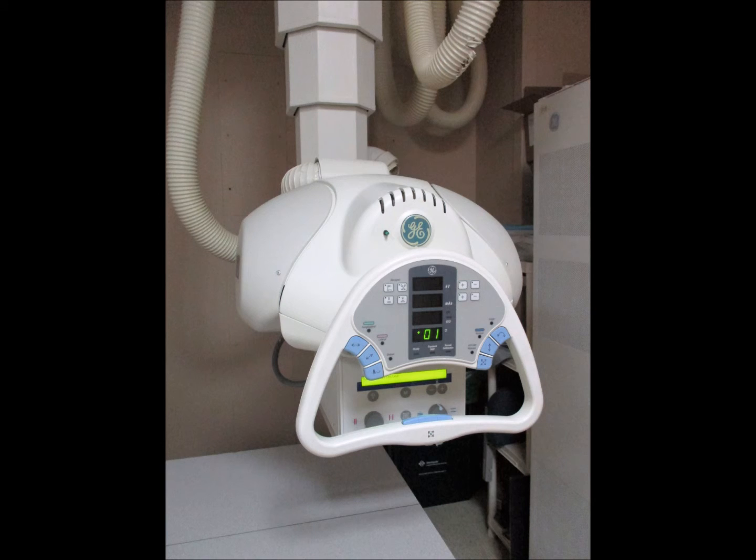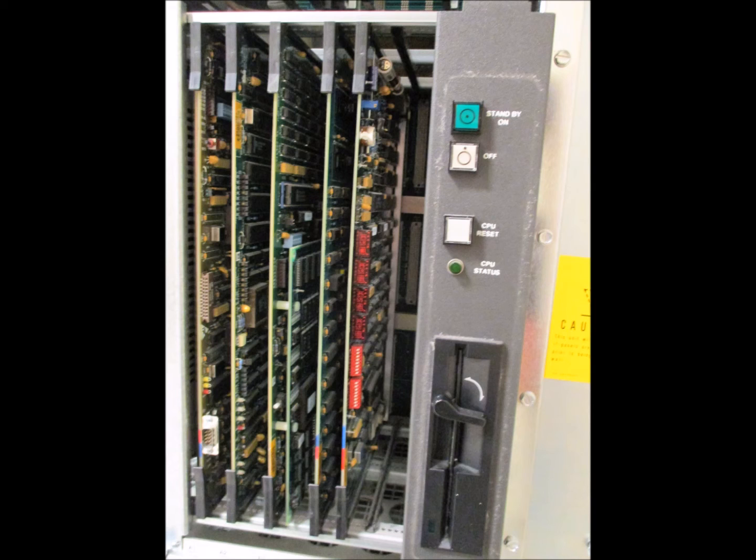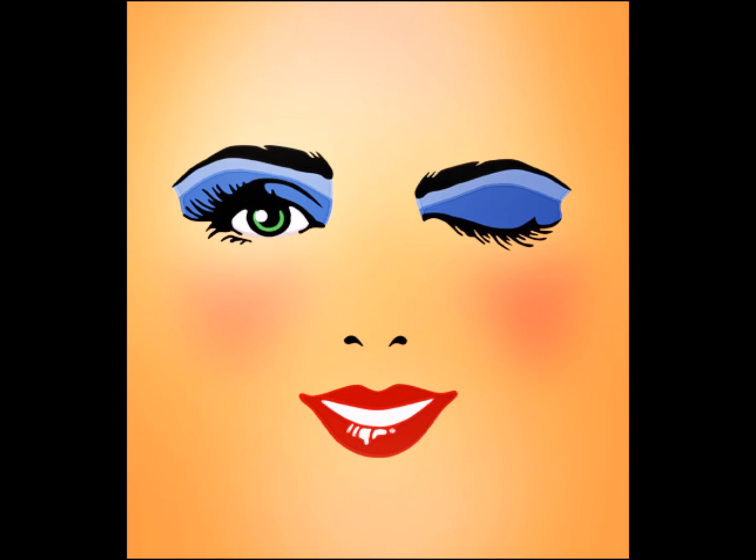Let me tell you why digital fluoro is great. It's a similar path that I take to the eye, but upon exit the photons fly into a sensor, a TFT, which is the place for my friends and me, where I'm quickly converted to a digital signal for purposes we all know, and that's that digital fixes everything for sure.